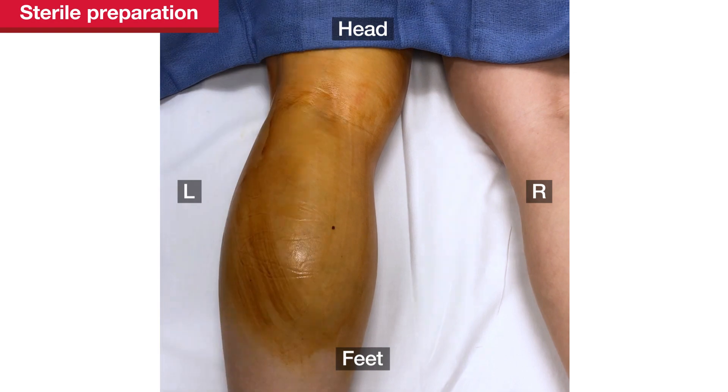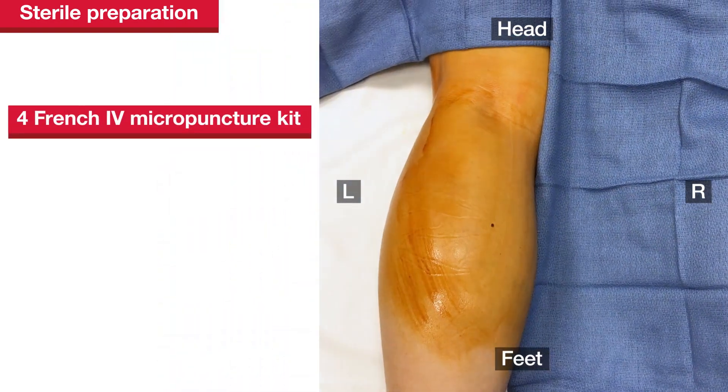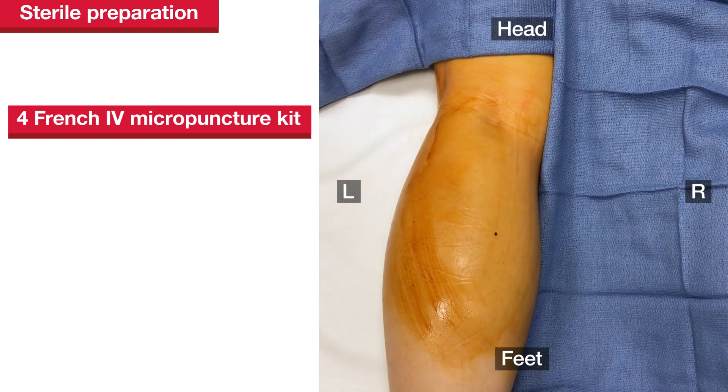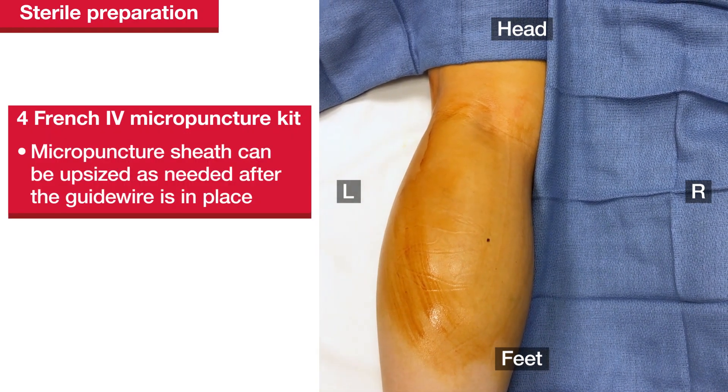First, sterilize the surrounding skin and drape the patient. A 4-French intravenous micropuncture kit is used. The 4-French micropuncture sheath can be upsized as needed after the guide wire is in place.